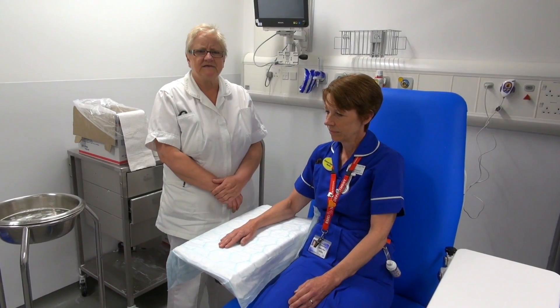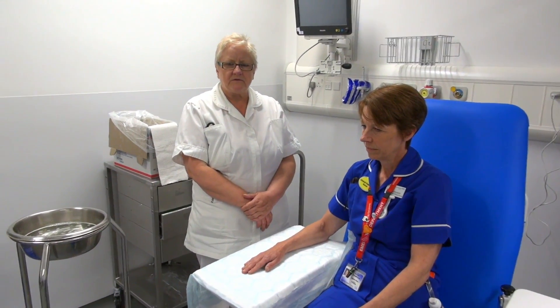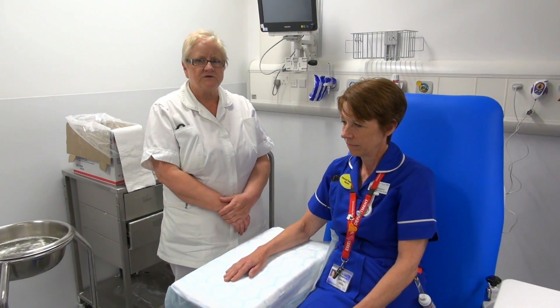Hi, my name is Pam Wilson. I'm the Plasticechnician at the Leicester Ward Infirmary ED Department. Today we're going to show you how to put on an ulna gutter slab.